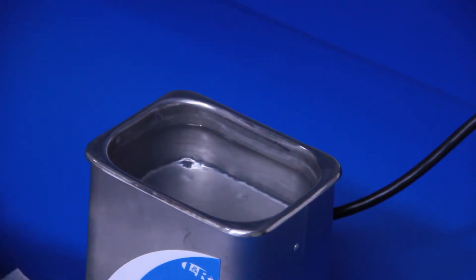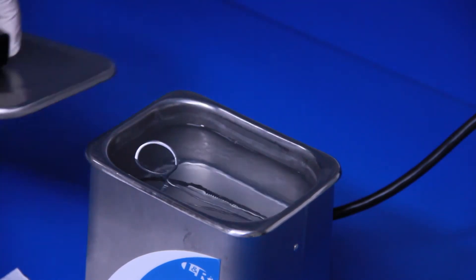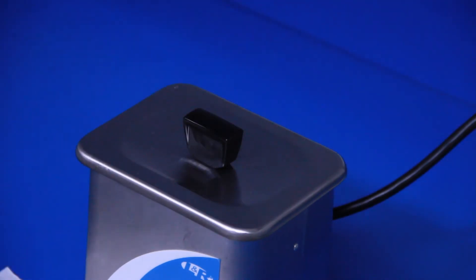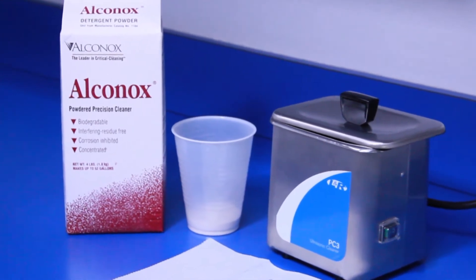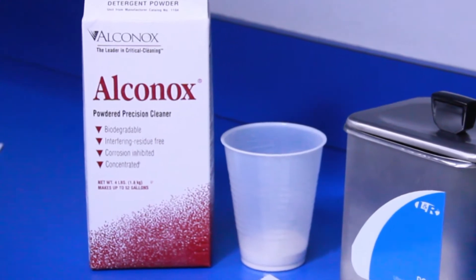Ultrasonic is the most effective cleaning method because of its cavitation. Vibrating sound waves create micron-sized bubbles in solution that grow as the pressure in the unit changes. Eventually the bubbles implode. The bursting bubbles effectively dislodge debris even in the most difficult to reach places. Use of ultrasonic detergent greatly improves the effectiveness of the cleaner because it increases the number of tiny bubbles.